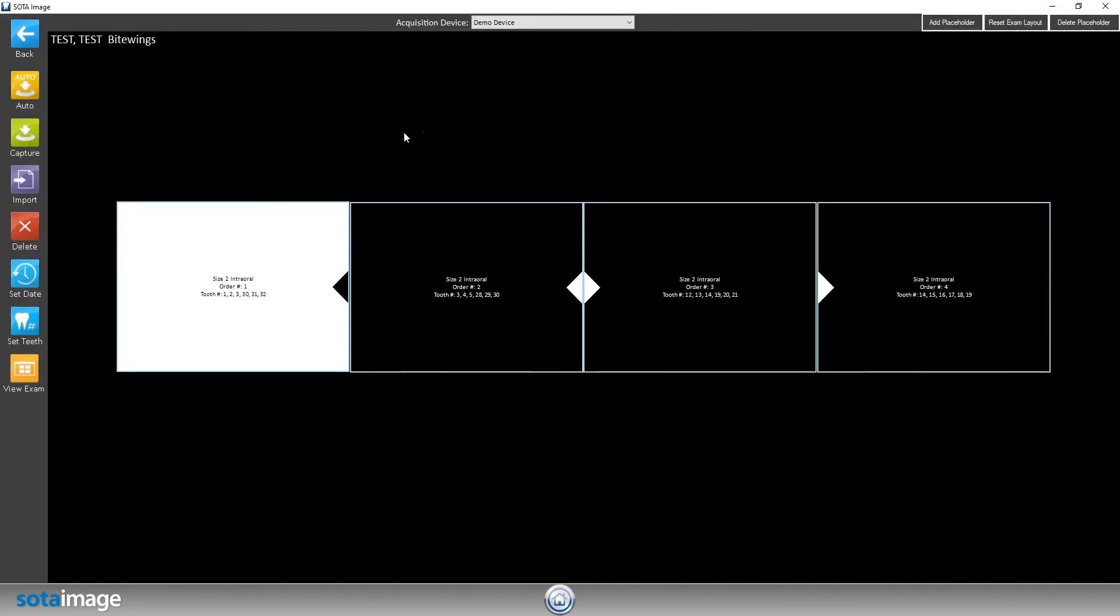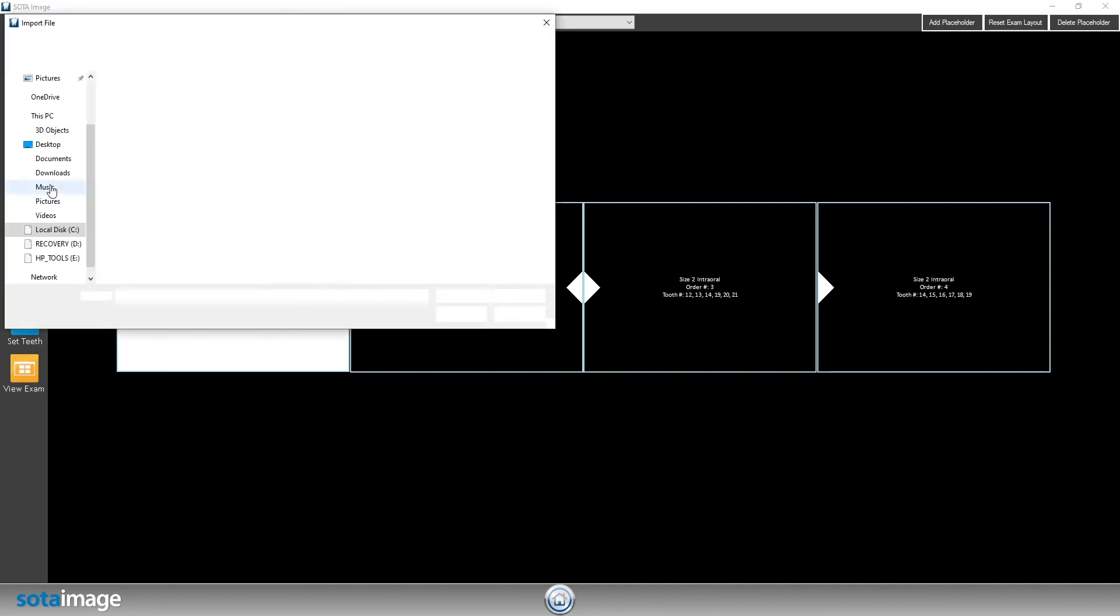From here, I'm going to click on import on the left-hand side, which will allow me to navigate to wherever my images are. In this case, they're already on the desktop.